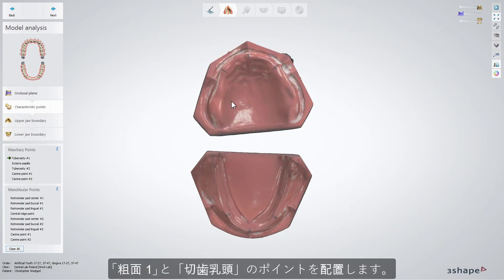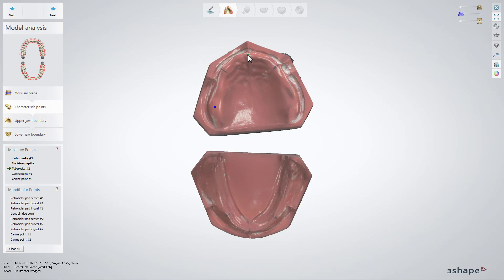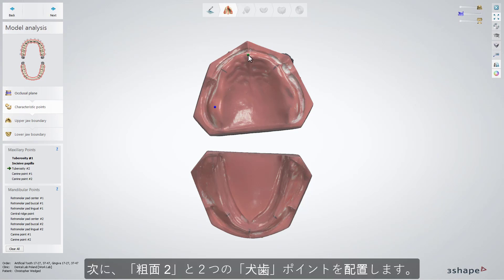Select the tuberosity, then the incisive papilla, the second tuberosity, and two canine points.